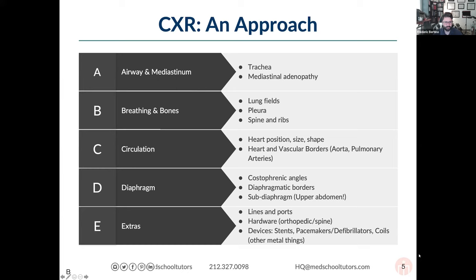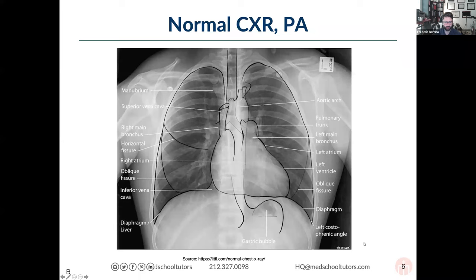What I'm showing everybody here is a normal chest radiograph in the PA projection, meaning the beam comes from the back of the patient and the patient's front is up against the detector — the beam goes from posterior to anterior, which is probably why they're named that. I'm going to take you through some anatomy with drawings and overlays over the chest radiograph to help identify normal anatomic structures.